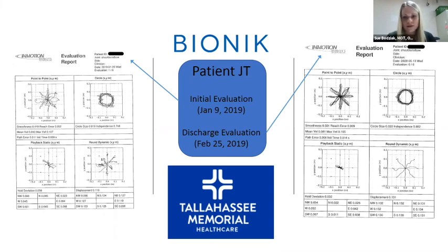You can take the percentages, they're right on there, and document them. I like to document how many reps the patient had done. That way I can indicate their endurance skills, and also I'll document how many times they started the movement. So that's really important as well.